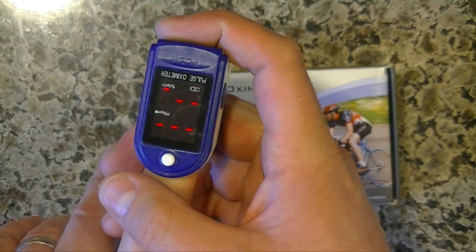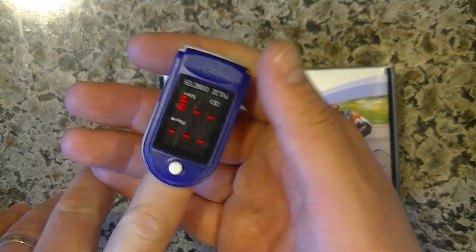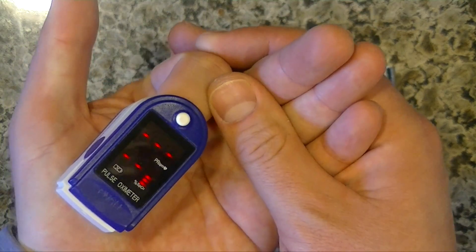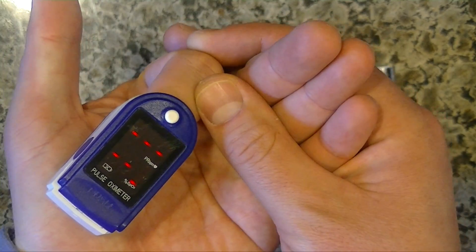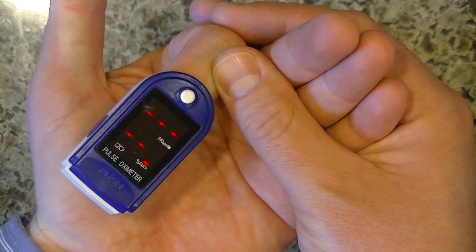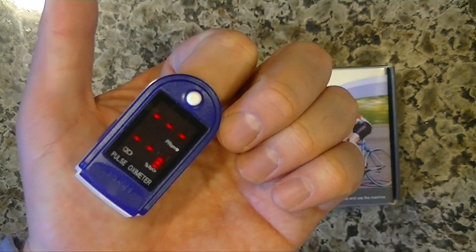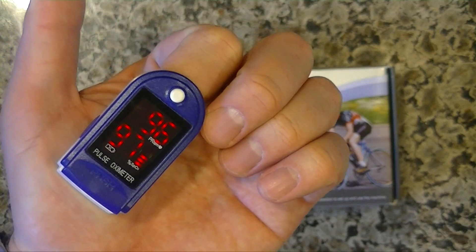I looked up online about what should be standard. 95 and above is good. If you have blood oxygen 89 or below, you're running some risks. If it's really low, you're running some serious risks. Cancer thrives in a low oxygen environment. Your body needs oxygen basically.